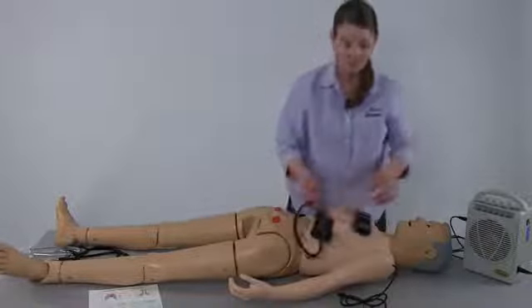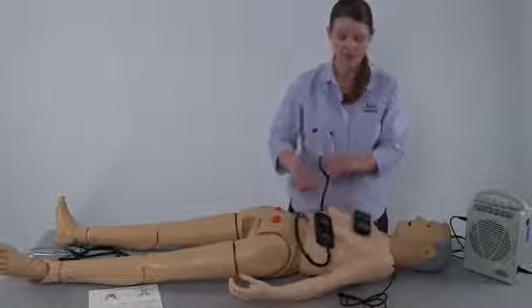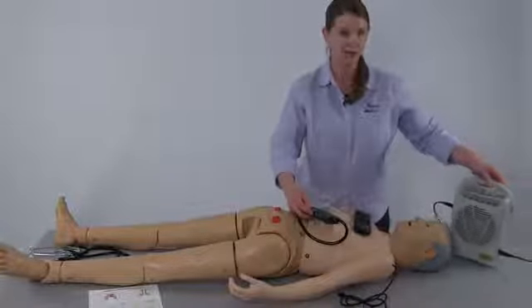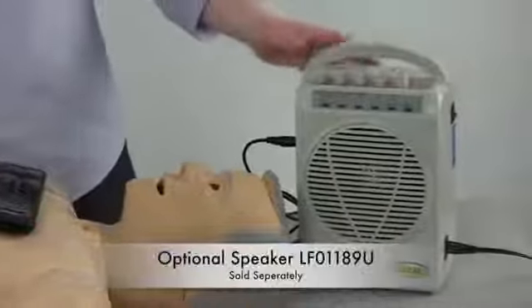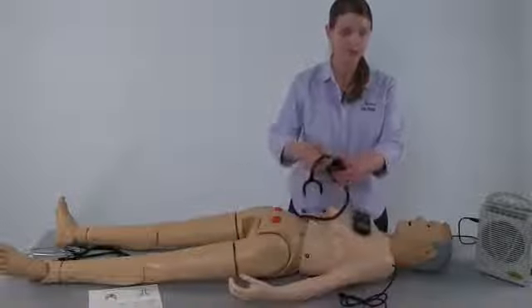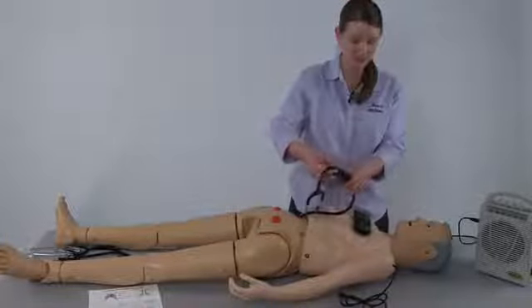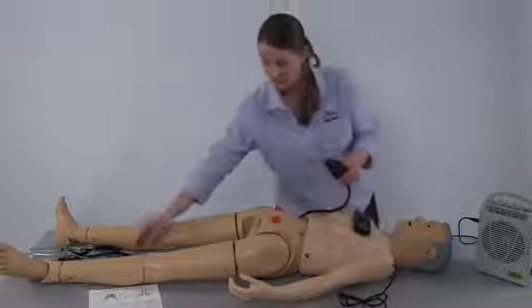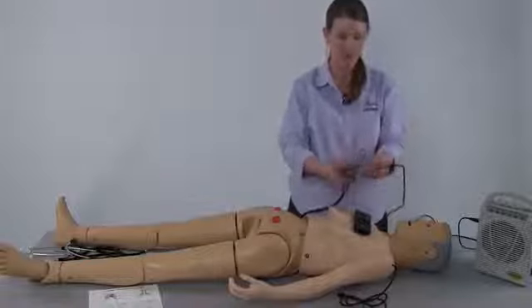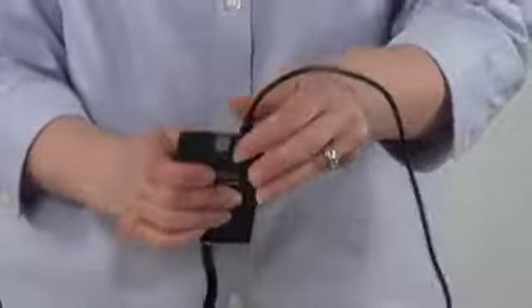Once the batteries are in place and you determine the method for hearing the sounds — ear piece or an optional speaker system — to use the optional speaker system, which we will do for this instructional video, you can detach the ear piece if desired, and then using a standard speaker cord, insert the speaker cord into the top of the smart scope.